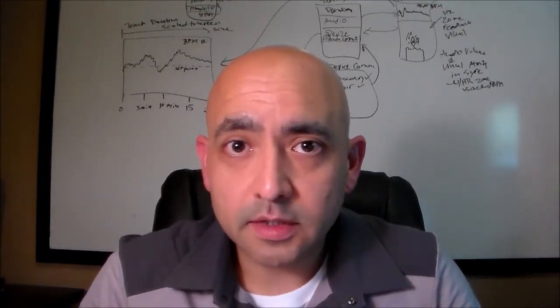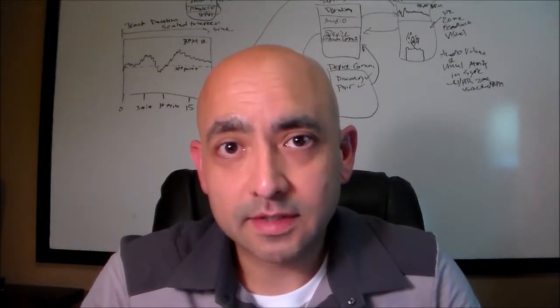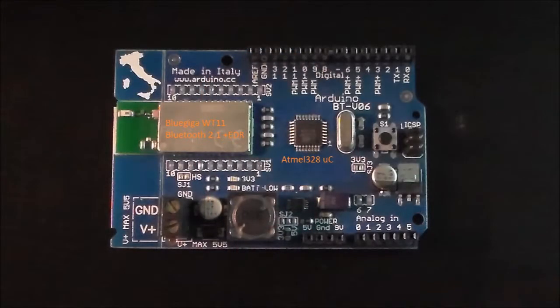I'm going to start by showing you the electronics that I put into this system. This is the Arduino development kit that's the base platform for the Holter monitor. It consists of a small microcontroller, the Atmel 328, and a Bluetooth 2.1 transceiver, which is the WT11 part by BlueGiga. Note that the WT11 also contains a small microprocessor that's dedicated to running the Bluetooth protocol stack. In a real product, both the stack and control software would run on a single processor, which reduces size and power requirements.